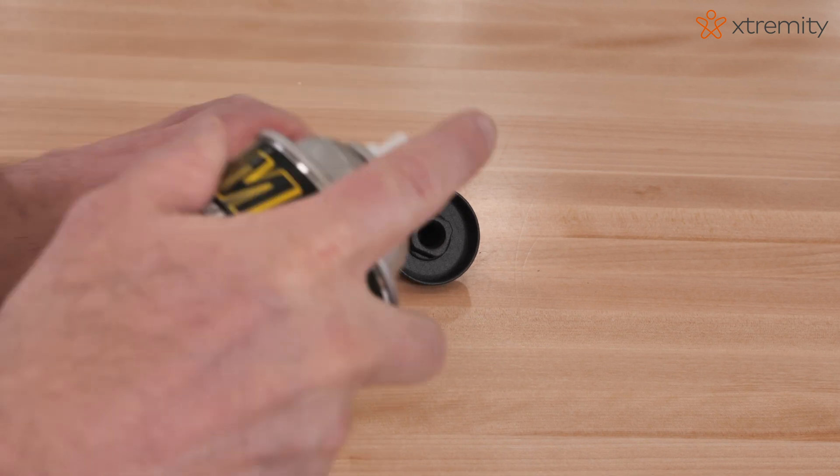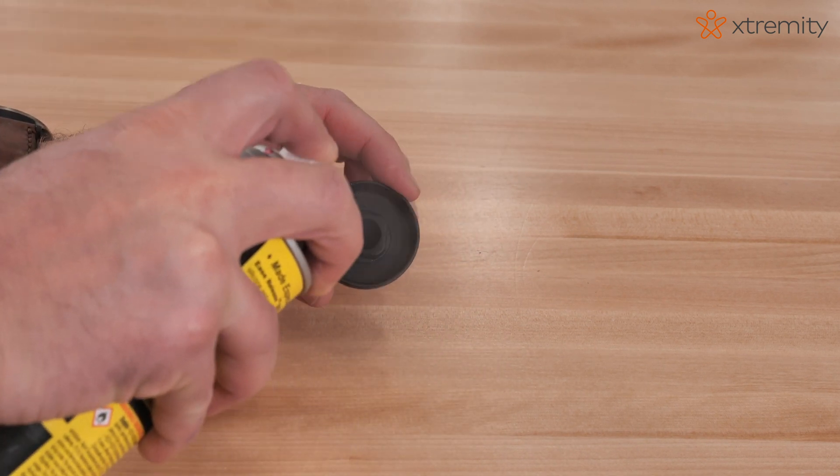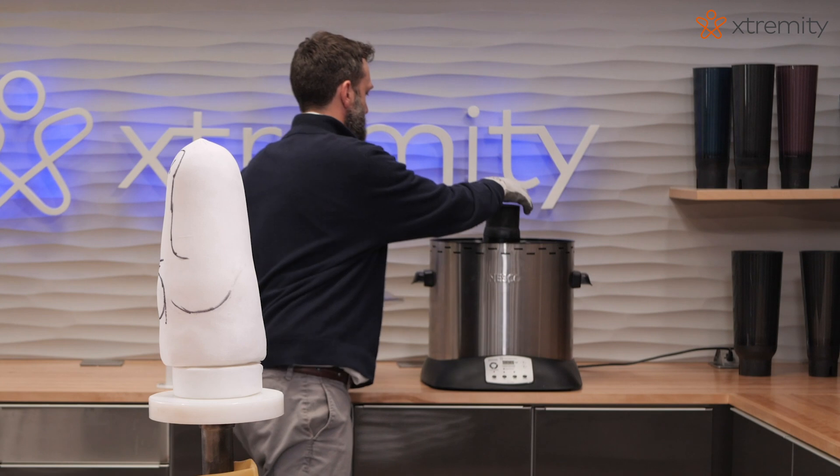Ensure all supplies are laid out next to the vacuum stand. Spray the distal end pad injection valve with mold release.